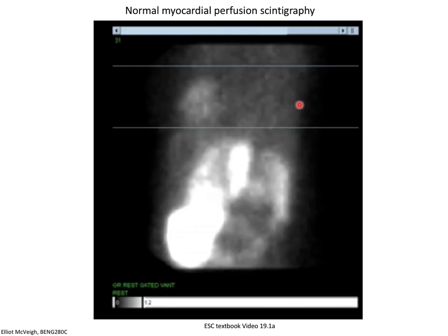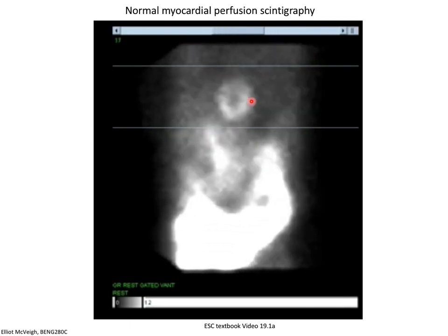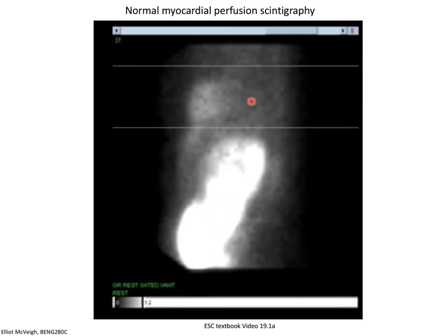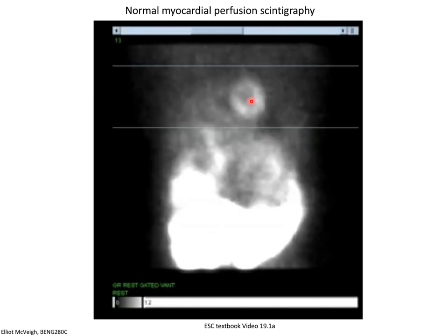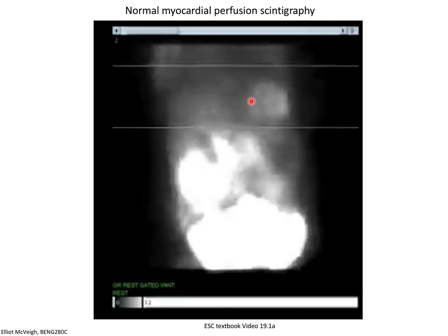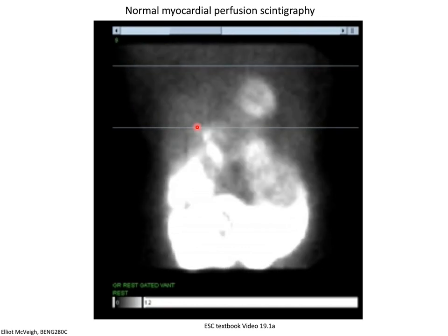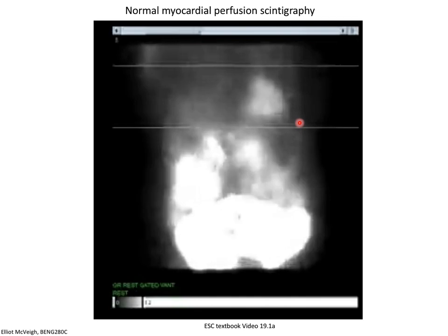And so if I have an activity at a certain rate in a volume, and I acquire data for a minute, and I get a certain number of photons, there's uncertainty in just that number of photons just from the statistics of how the photons are generated. So you're going to get a higher and lower number in different trials just based on the fact that you get a higher and lower number of photons produced and detected. And so that's what causes this noise, right? It's not a really high signal-to-noise signal.